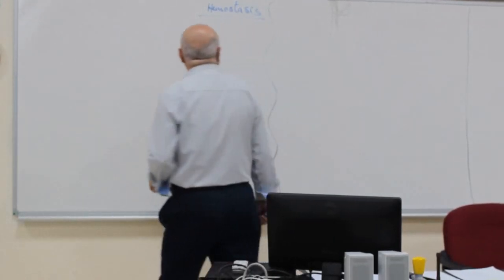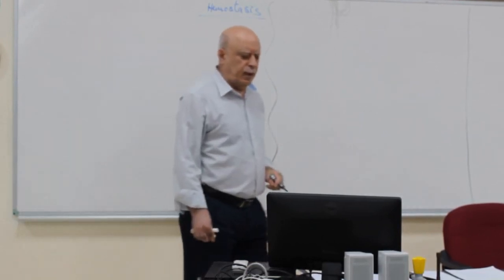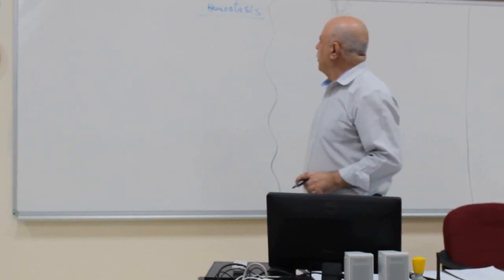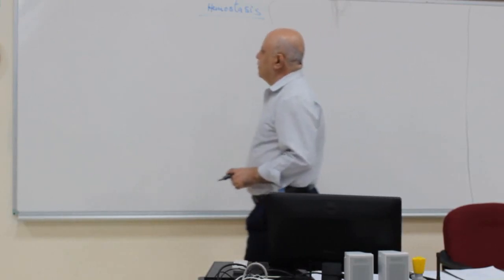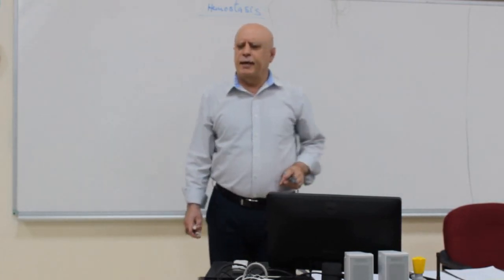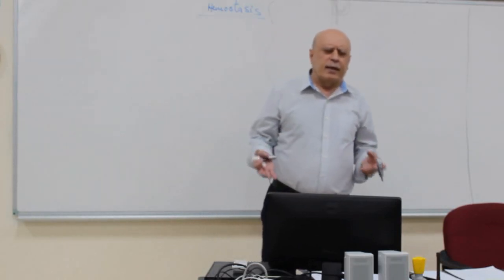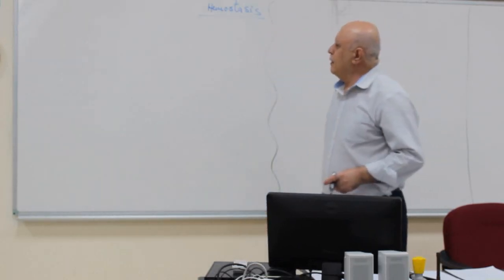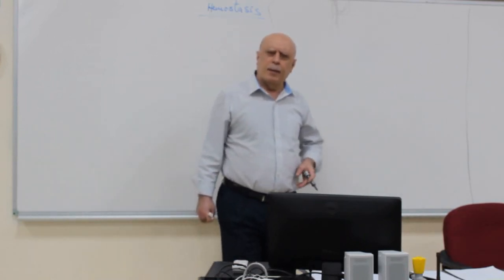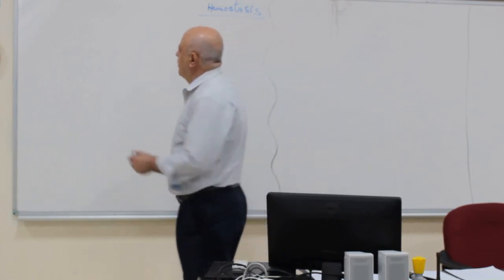Okay, today we're going to talk about hemostasis. This is the second part of the second half of the hematology and coagulation lab. What's hemostasis? Hemostasis is the process of retaining blood in the vascular system in a fluid state. In other words, the process of stopping bleeding when damage occurs to the blood vessels.